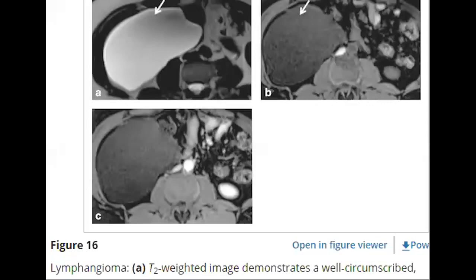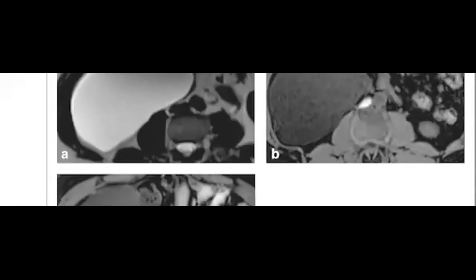Just to know the differential diagnosis, you need in the exam to just have some list in your mind what it could be. Sure, that is not just one diagnosis, but just to know the criteria that help you to differentiate between the lesions. Again, let's take this scheme if it can help you.